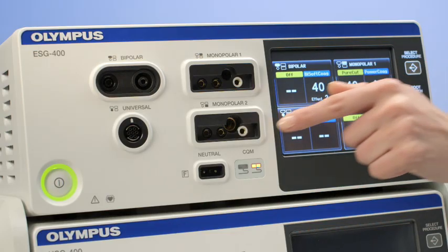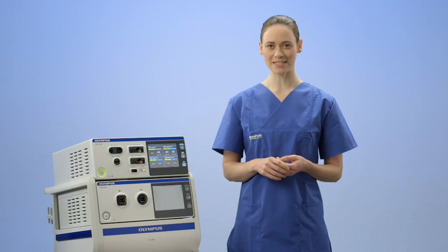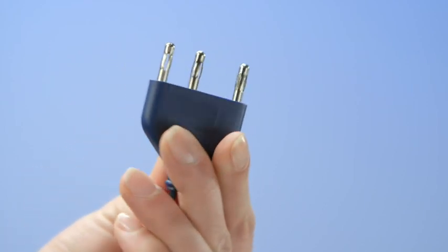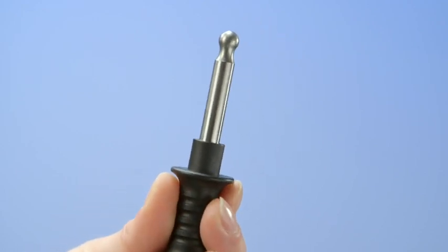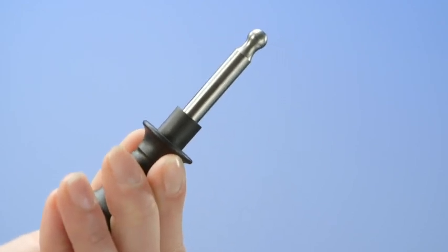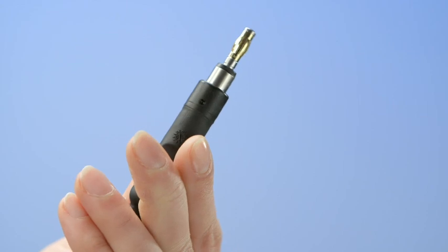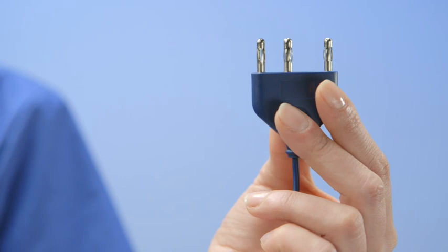A dispersive electrode — also called a patient plate, ground plate, or neutral electrode — is also part of the connection area. The most common monopolar plugs include the three-pin international plug, the four-millimetre banana plug, the eight-millimetre Bowie standard plug, and the five-millimetre Erby standard plug. The most common plug is the three-pin international plug.